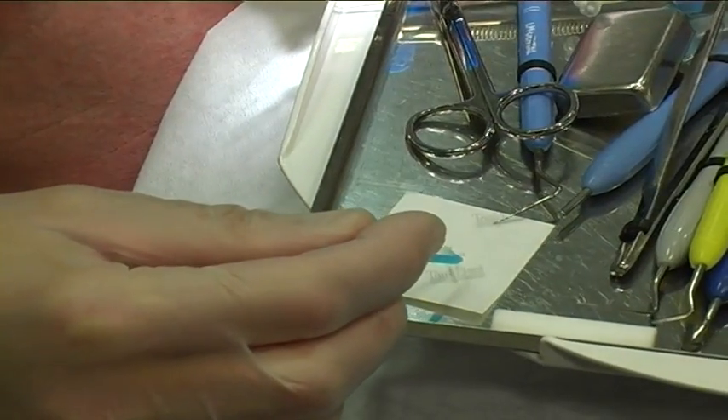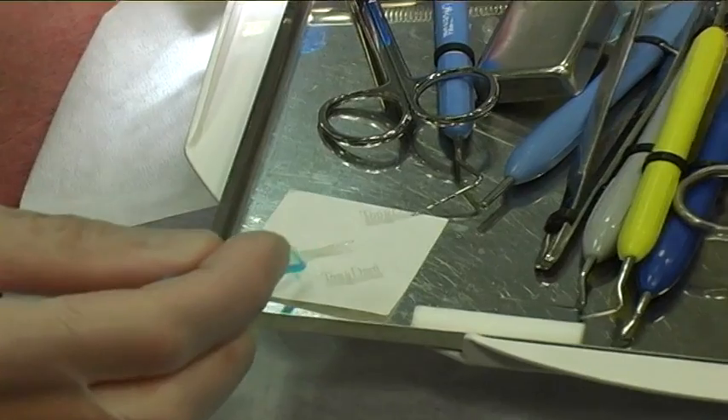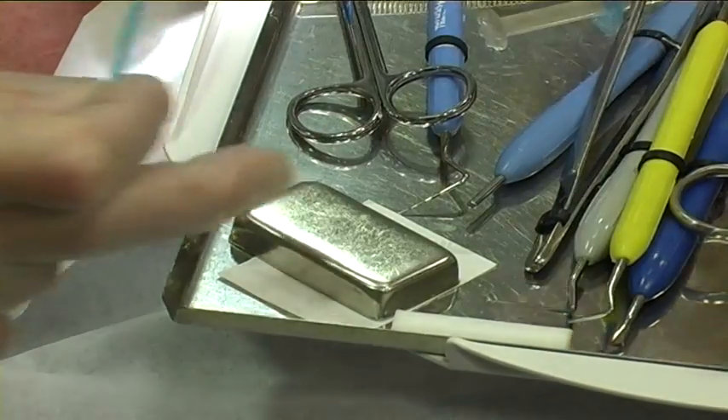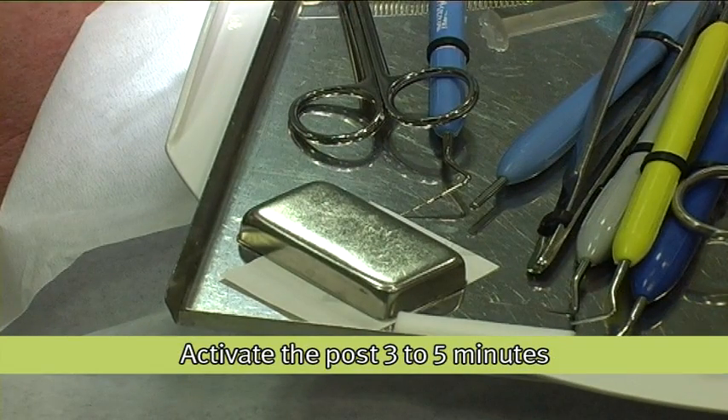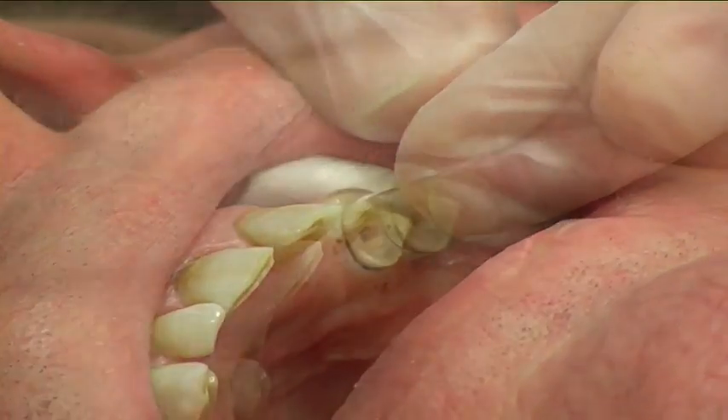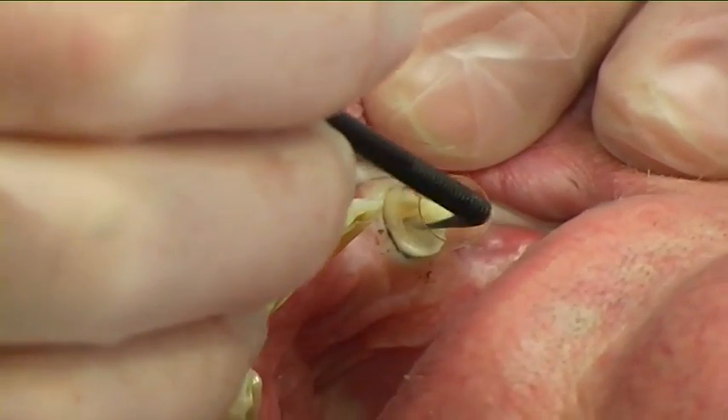A layer of enamel resin was applied onto the post's surface to activate the IPN feature. The post was then covered from light until it is cemented. The core matrix was placed and the root canal was bonded according to the cement manufacturer's instructions.